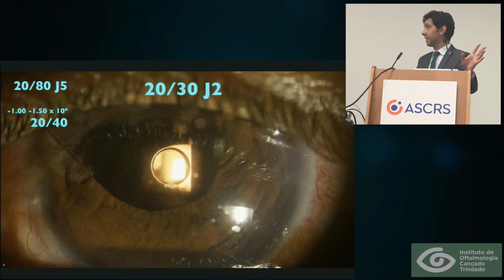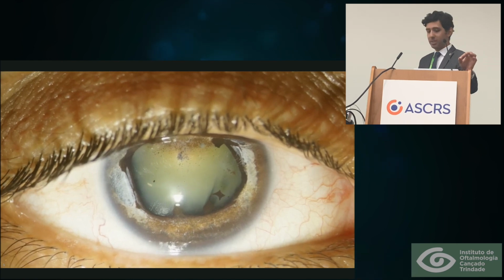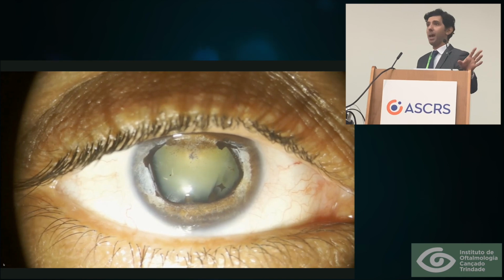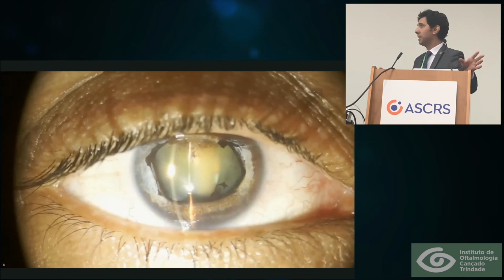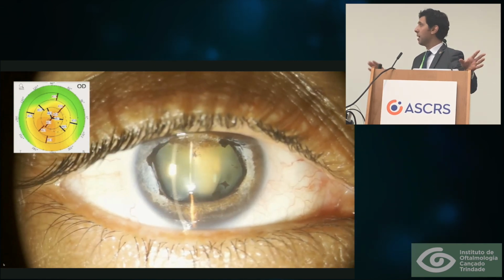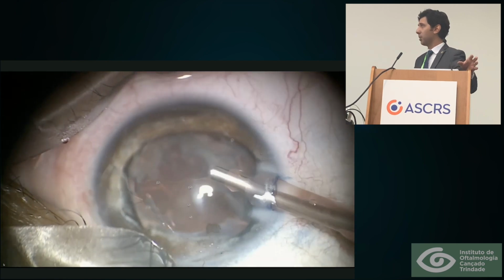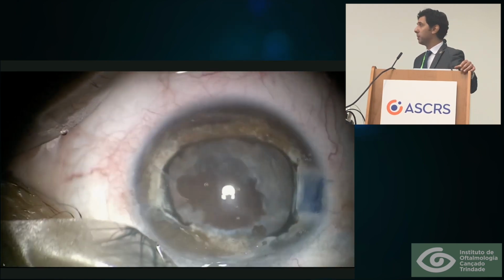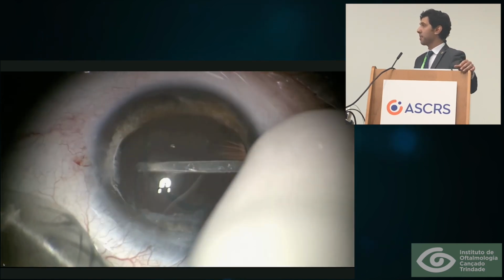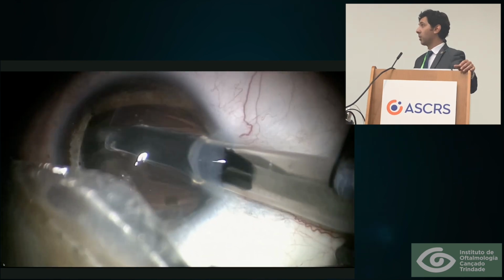And I'd like to share a second case, which is similar. This is a keratoconus patient who had a terrible result after an anterior chamber phakic IOL implanted in the past. He had an IOP spike in the first day. The lens was removed a few hours after implantation, but the damage was already done. He was left with this terrible iris atrophy and a large pupil. And here, recently, after his cataract surgery, we implanted the extra focus pinholing device in the sulcus.